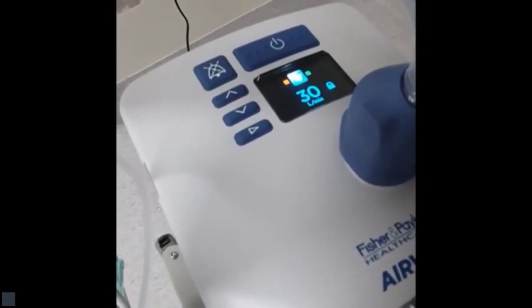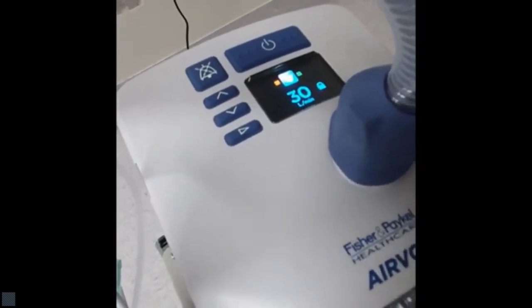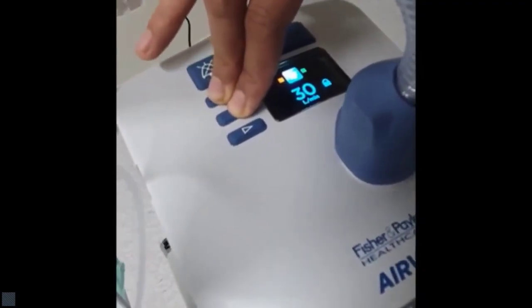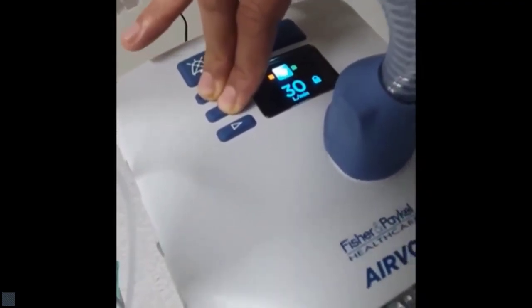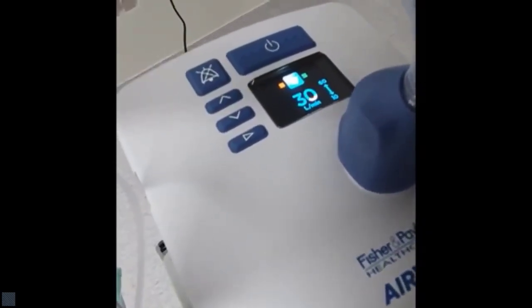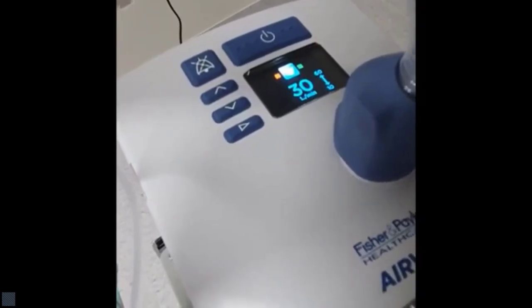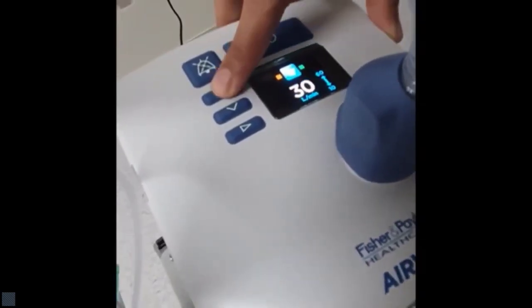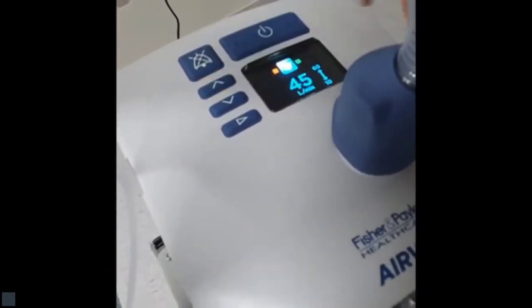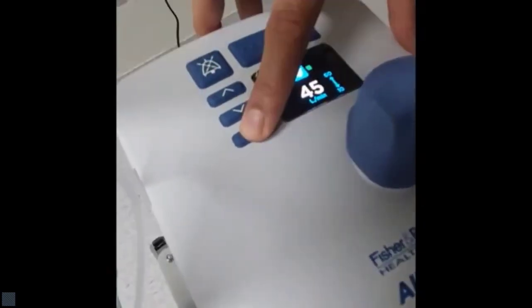Flow rate: press and hold both up and down buttons together for 3 seconds, as shown, to unlock settings. The padlock symbol will now disappear. Use the up or down buttons to adjust the gas flow rate. Recommended rate is 45 liters per minute. Press and release the mode button to lock the screen.